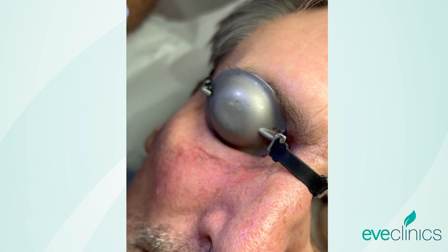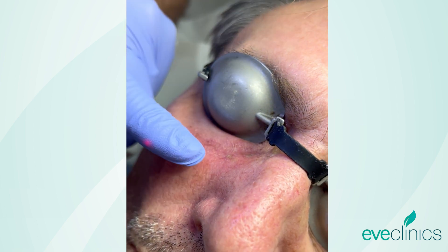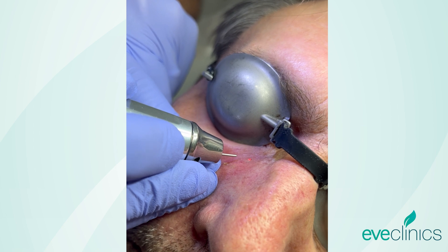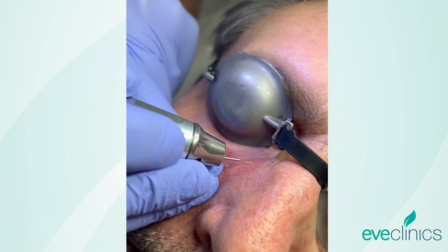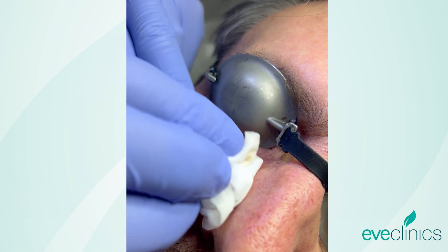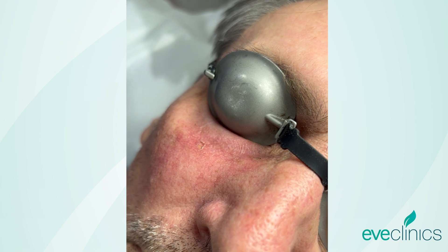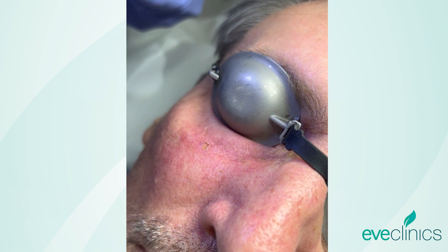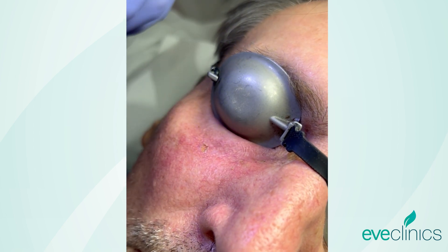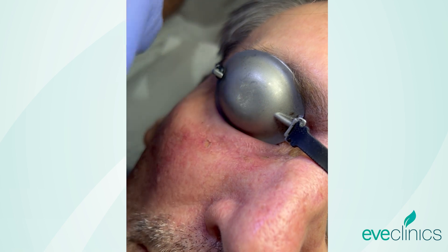There we go — that's got it. That was the sort of old sebum at the base of the gland. What causes them? The skin waterproofs itself using a whole bunch of specialized glands, but sometimes the drainage of those glands can get blocked. Usually it's simple issues with dirt and dead skin cells, but also the overzealous use of products like moisturizers and makeup can block these up.